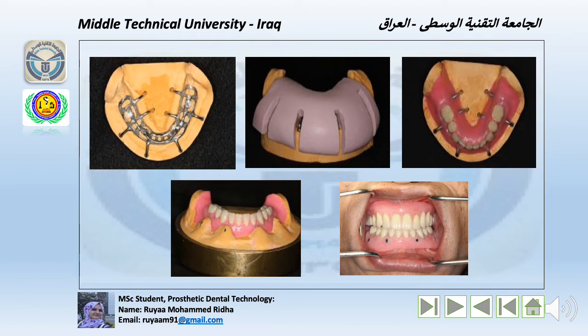Then set the artificial teeth on the metal framework as in the conventional method. Then the final overdenture is waxed up, encapsulating the metal framework prior to the investing and processing procedure. Then the framework is secured in the flask drag with dental stone investment. They complete the flasking as in the conventional method and finish and polish the final denture.